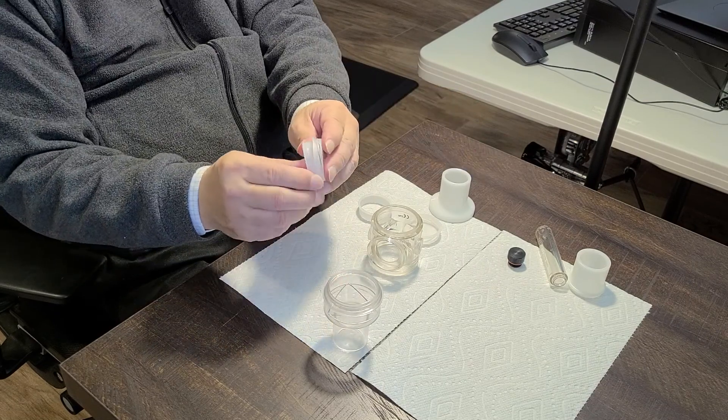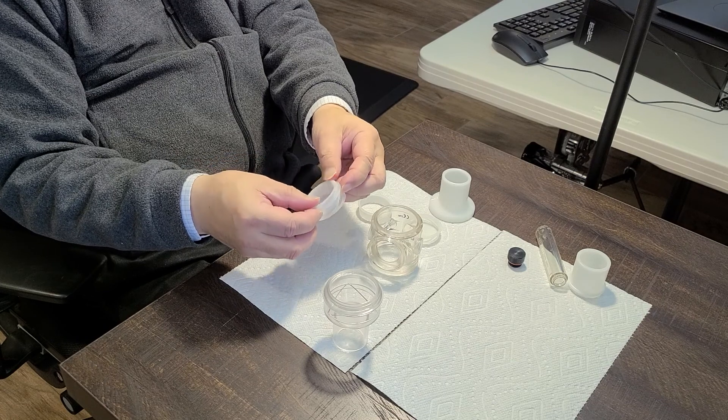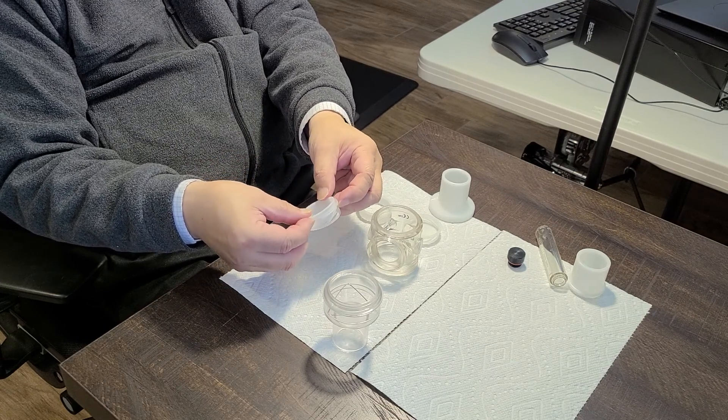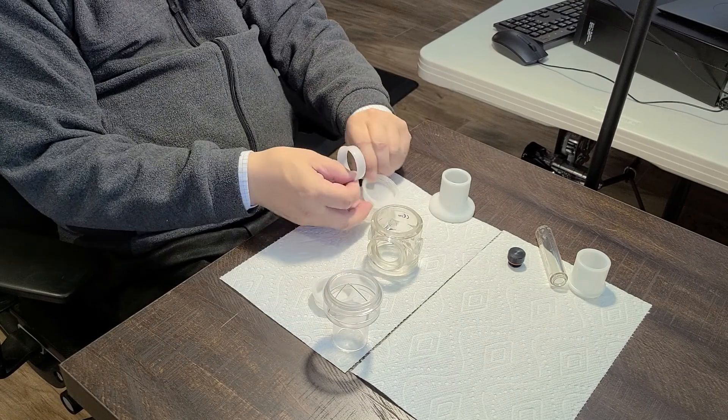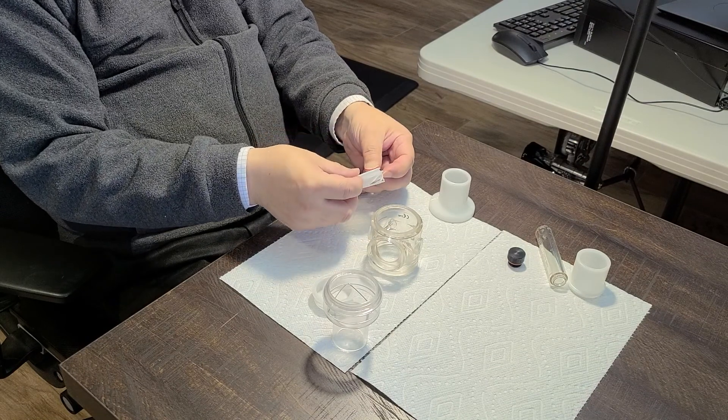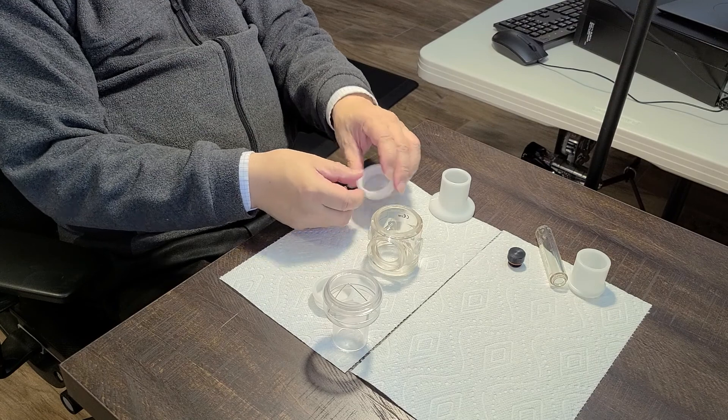First, reassemble the valve. Fit the spiral diaphragm loosely to the diaphragm ring using the eight-finger technique.